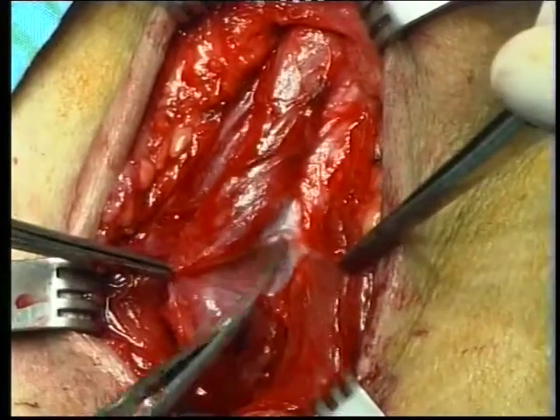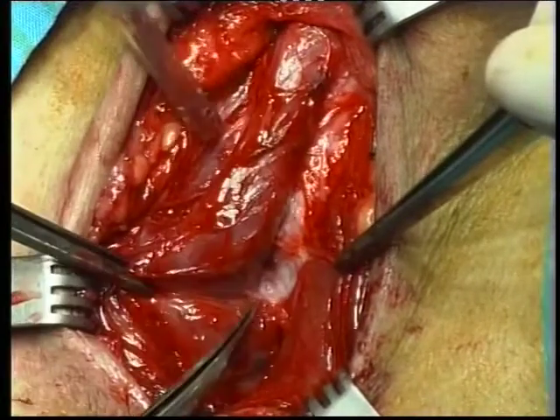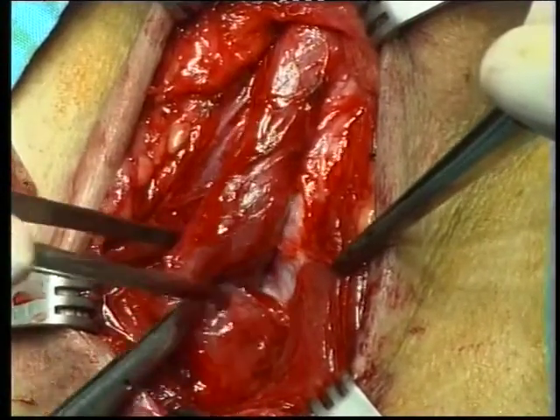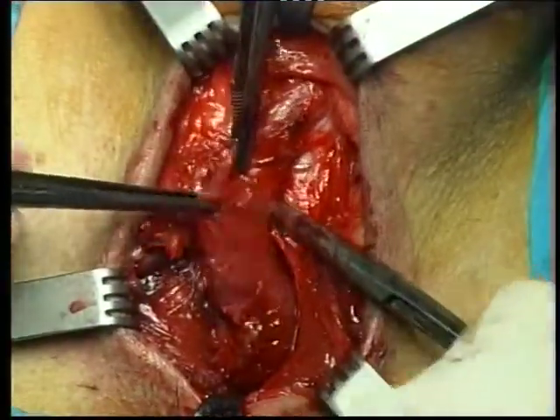Slight urethral traction with the loop facilitates the urethral mobilization in the midline, where the spongiosum and corpora cavernosa are adherent and sharp dissection is required to separate them.